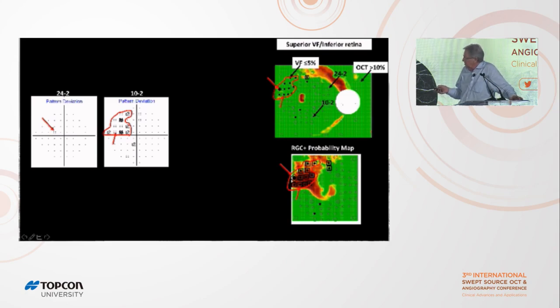Well, this is a continuous probability map. Green means not significant, probability greater than 10%. Dark red is going to mean 0.1%. Red's about 1%, yellow's about 5%.